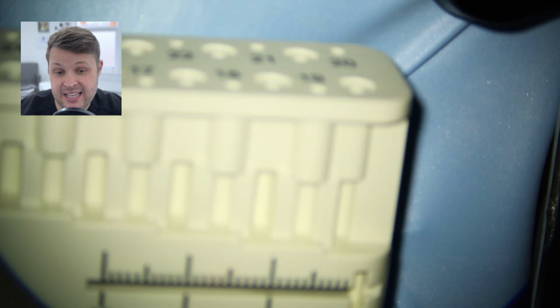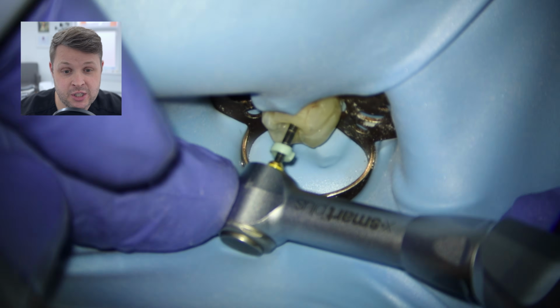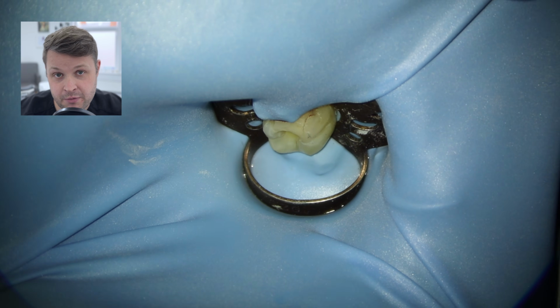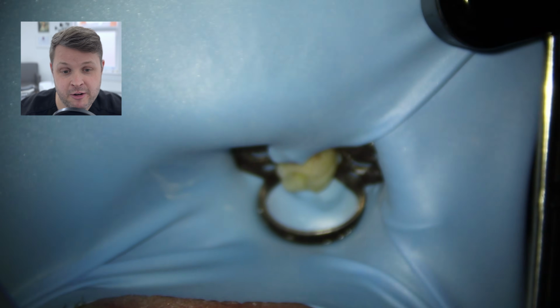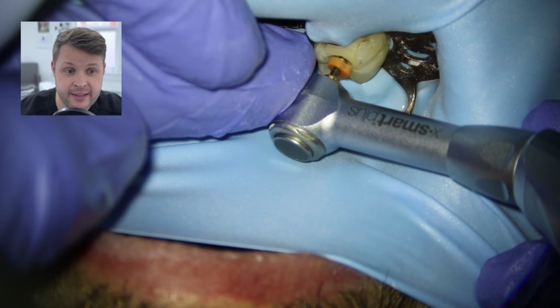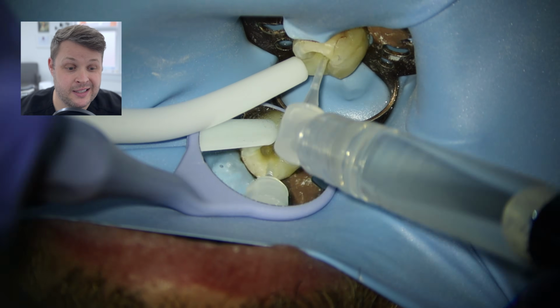And then it's the same protocol with the MB: lots of recapitulation, size 15 03 high flex, size 20 04 high flex, and 25 variable high flex. And then that's it, 2 canals nicely shaped, and now we're ready to go onto our distal canal.